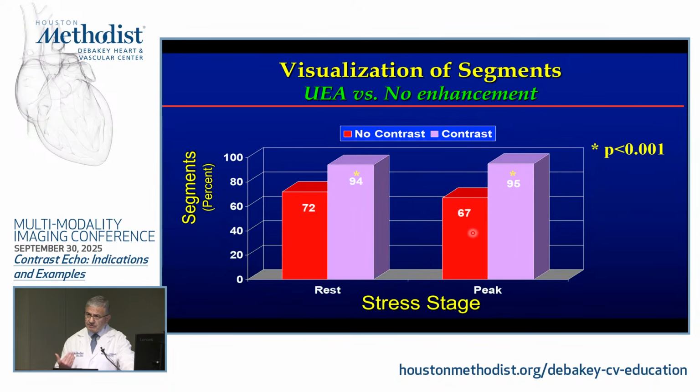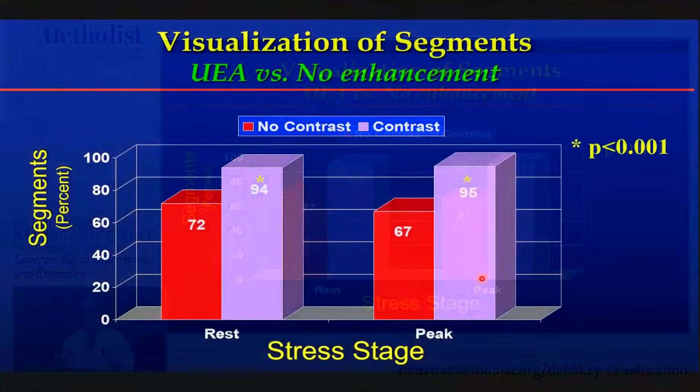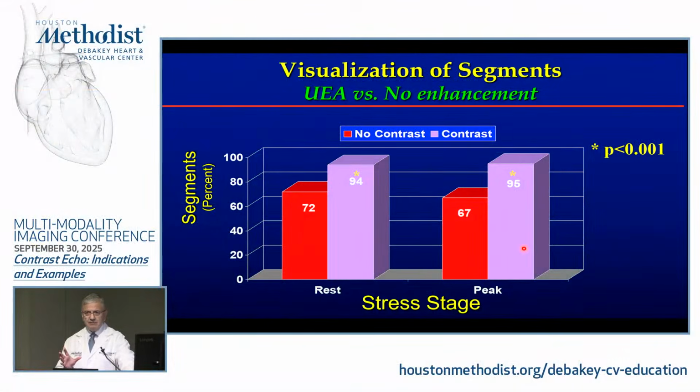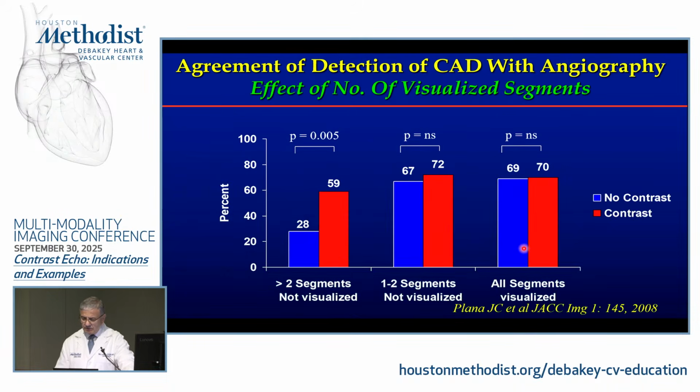Whenever you have stress, your imaging goes down, as opposed to staying the same or up. This is from the interpreting physician's point of view: make the decision before you do the stress. Be it exercise or be it pharmacological, if the study is pristine to start with, use contrast at rest, so you can compare contrast to contrast later on during the stress.